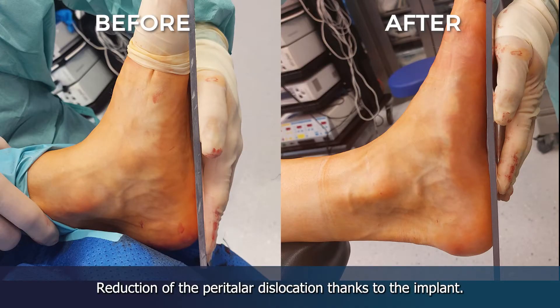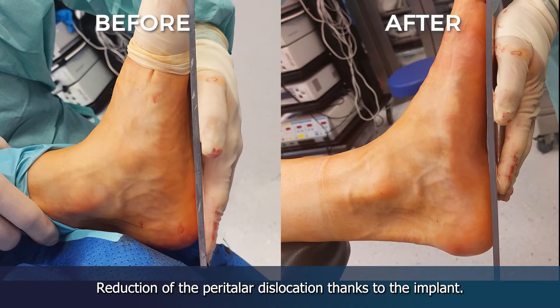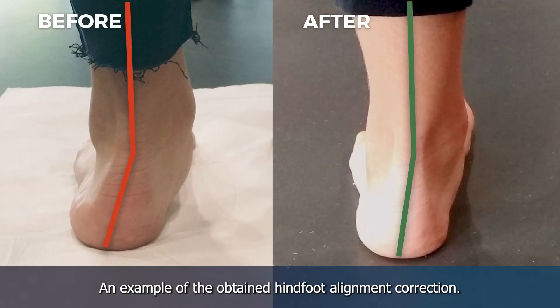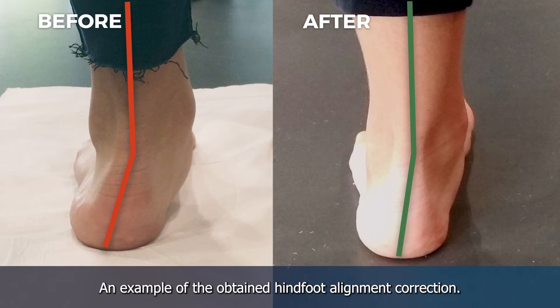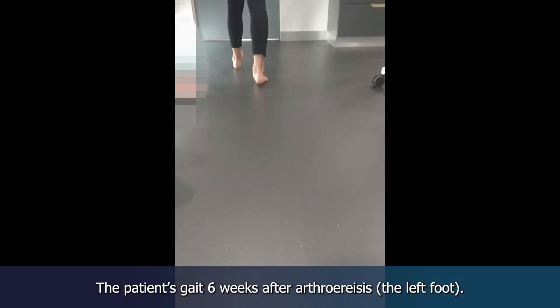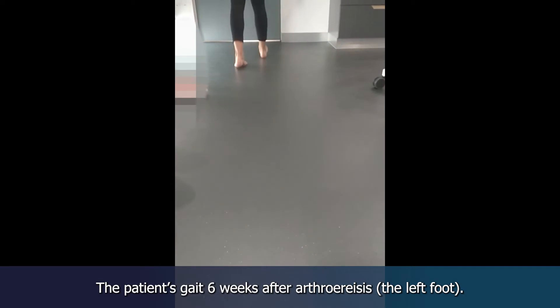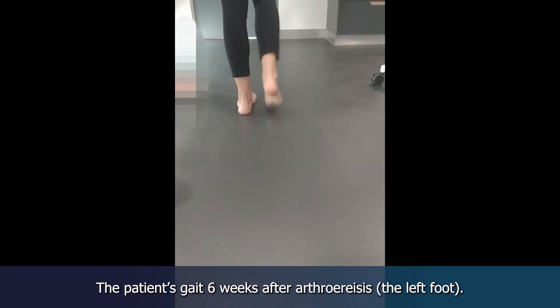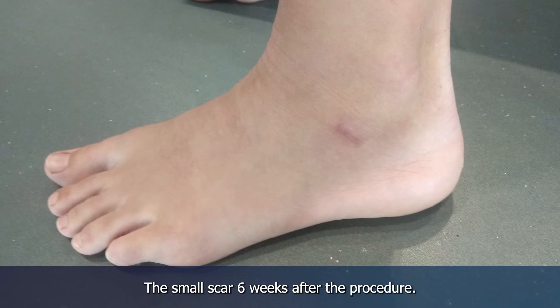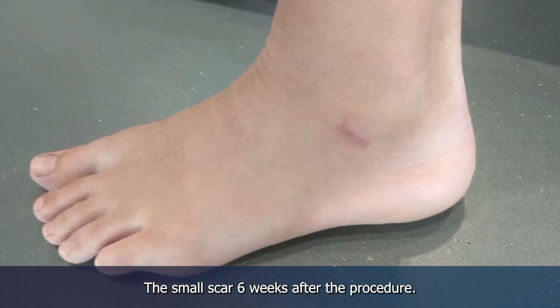Thanks to arthreoesis, we achieve reduction of the peritalar dislocation. In the picture we can see an example of the obtained hindfoot alignment correction. The patient's gait 6 weeks after arthreoesis. The small scar 6 weeks after the procedure.